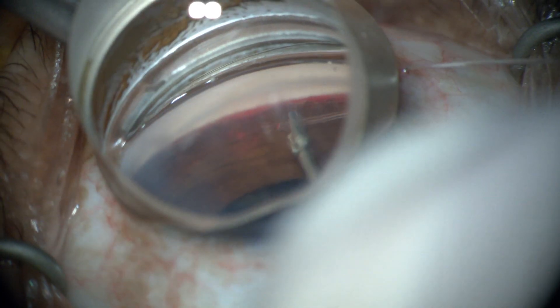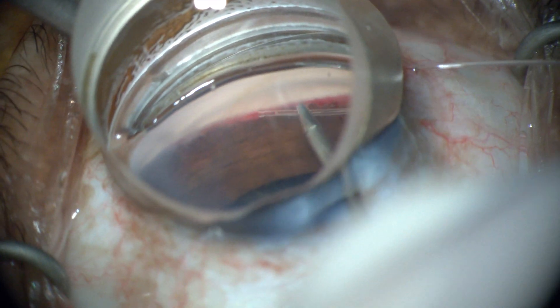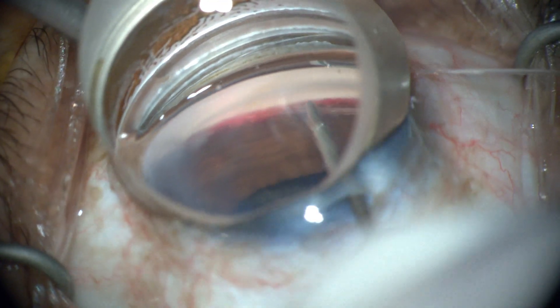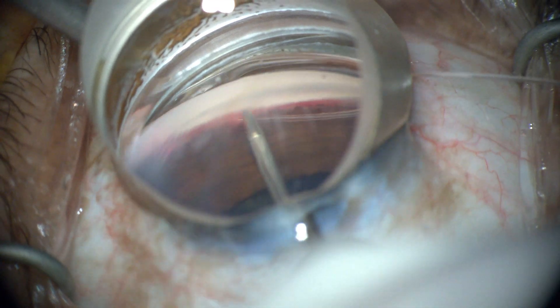The tip of the microcatheter is then grasped with micro forceps and intubated into Schlemm's canal at an outward and upward angle. It is advanced until the illuminated tip returns to the goniotomy 360 degrees.